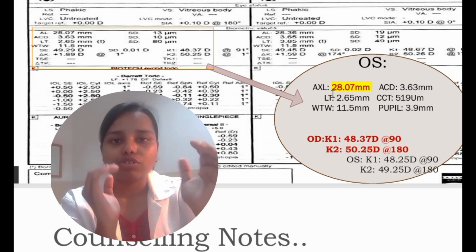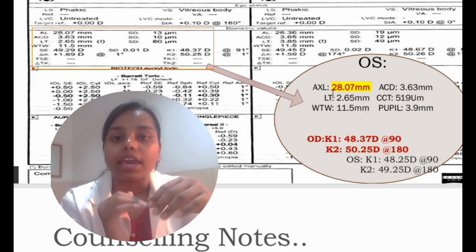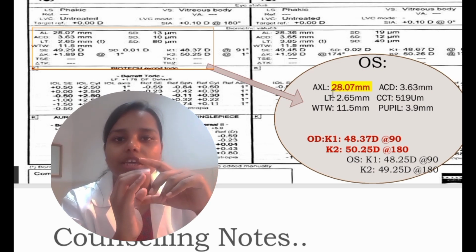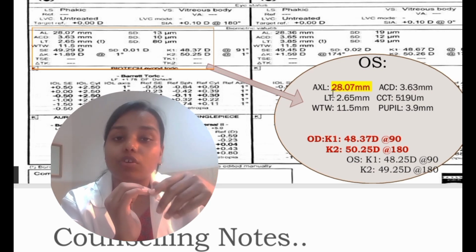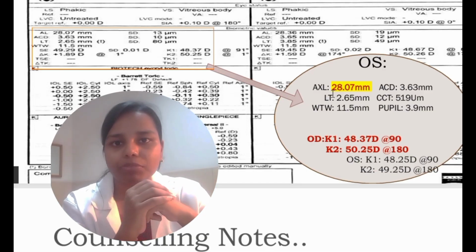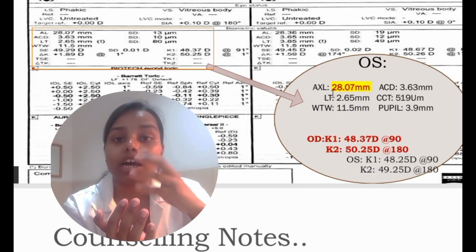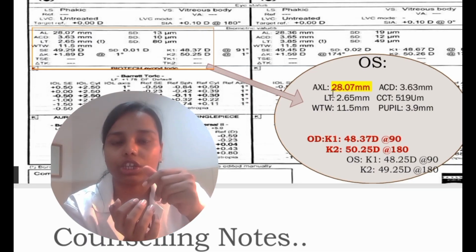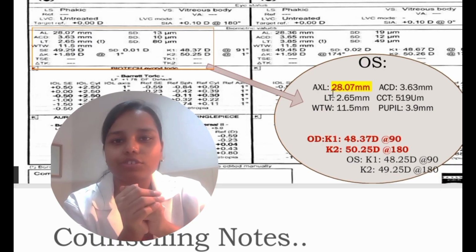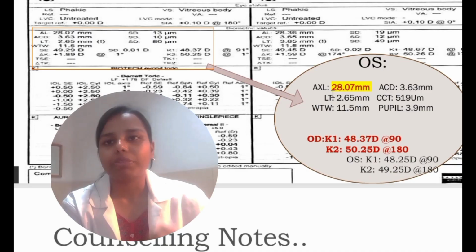So the axial length is more, for that myopia will be there to a particular amount. Again the cornea is also steeper like this, so it's working as a convex lens. For that also it will create a high myopic condition, right? So in every aspect we can see the patient is having high myopia, high refractive correction of myopia. It's getting interesting, right? So further we can proceed and see what happened to this patient, okay?